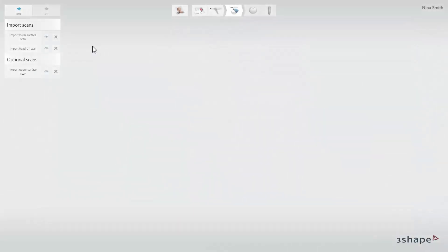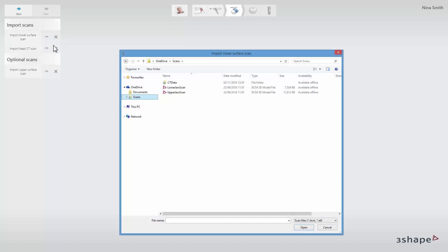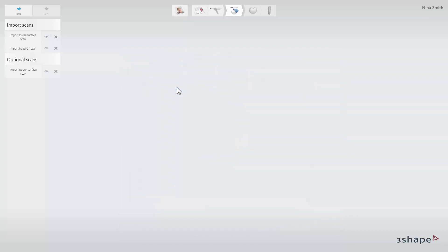To import surface scans, click Import Lower or Upper Surface Scan, and find the correct STL or 3-shape DCM file in the folder where the scans have been saved.